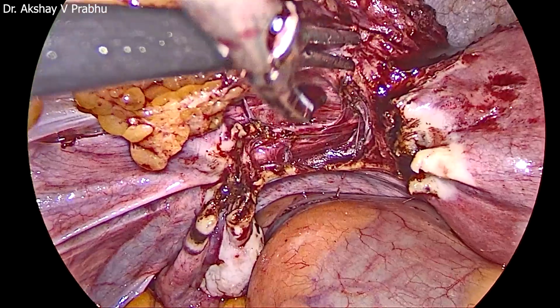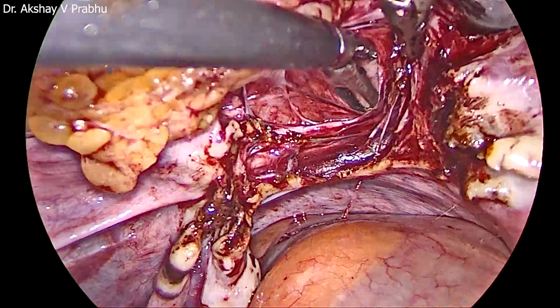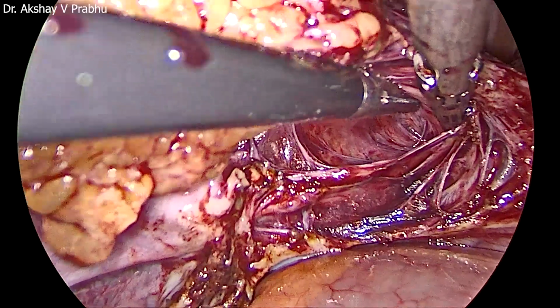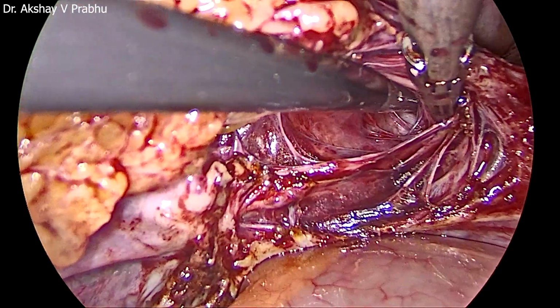Okay, now things are more clear. If you can see, from the left side I've got a plane where I am below the bladder. I'm trying to join it to the right side. See, now it's very clear. That is the cervix. You can see down the white part.